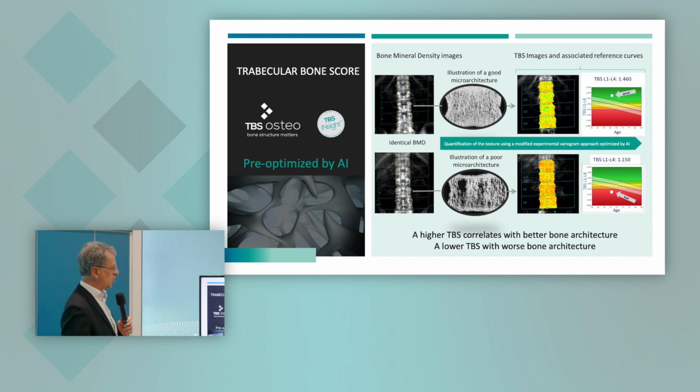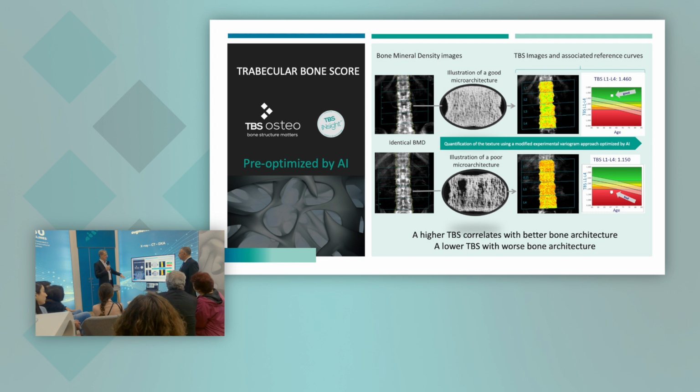TBS. So what we have is, you can have exactly the same density, and the underlying structure can be different. And if you have the same density but different structure, with one more solid than the other, then obviously, medically speaking, you will take a slightly different pathway for given patients.